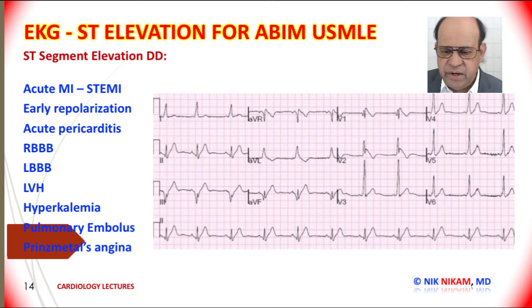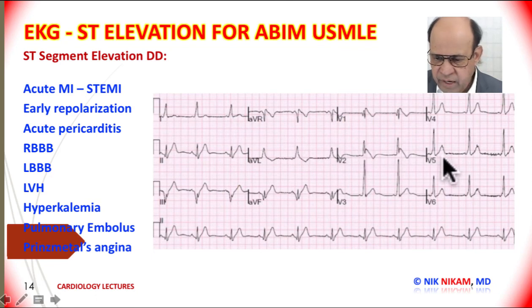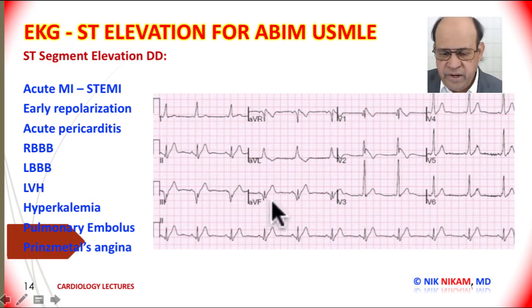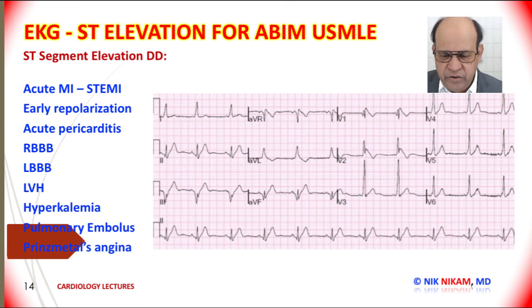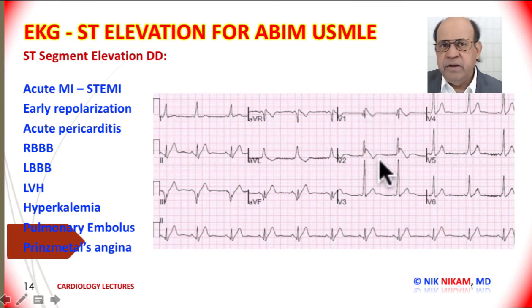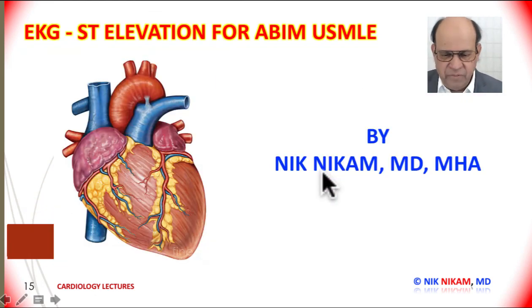What is your diagnosis here? We have a short PR interval and a delta wave, very clearly seen in the lateral chest leads. We have QS complexes in leads 3 and AVF, and then ST segment elevation. We are dealing with Wolff-Parkinson-White syndrome. WPW syndrome can present with a short PR interval, delta waves, and sometimes ST segment elevation in various leads, along with Q waves in the inferior leads and tall R waves in the anterior leads — all variations of WPW.